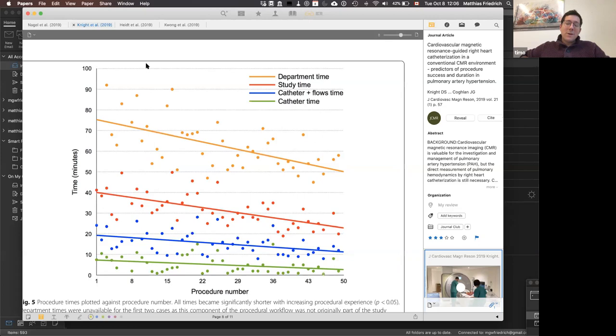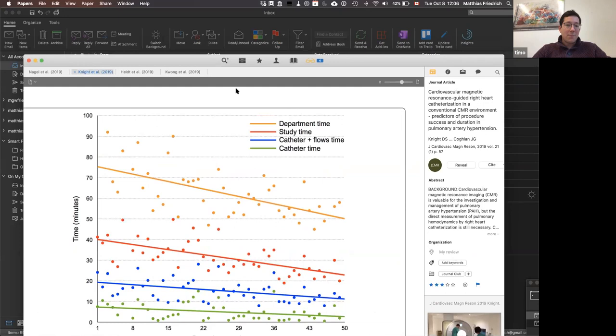So actually we started using 3T because one of our projects, which is not mentioned in this paper, is going into molecular contrast agents. And therefore we think that the 3T environment will give us some benefits there. This was what triggered us going into the 3T direction. Because our goal in the future would be to actually track an inflamed coronary endothelium in the MR scan, basically find the vulnerable plaque and seal it by MR-guided intervention. So this is really our road ahead, I would say. Of course, it's a far future perspective.